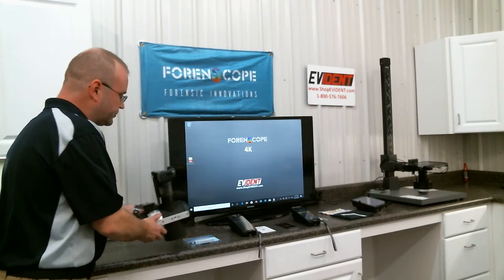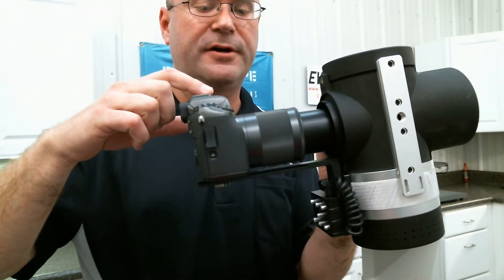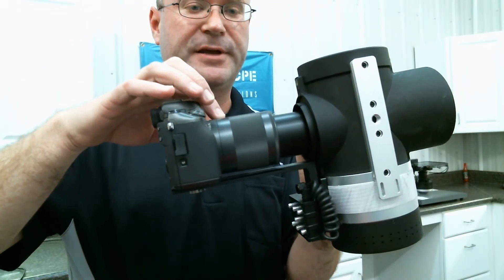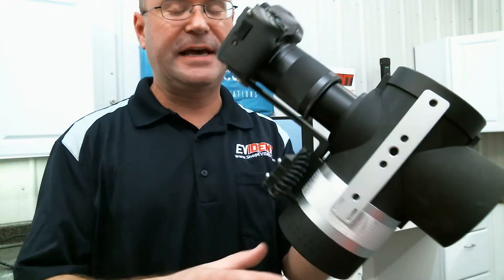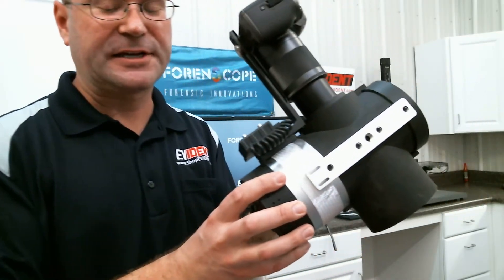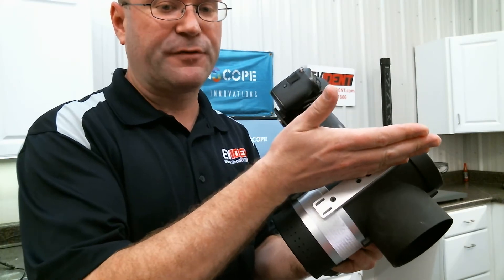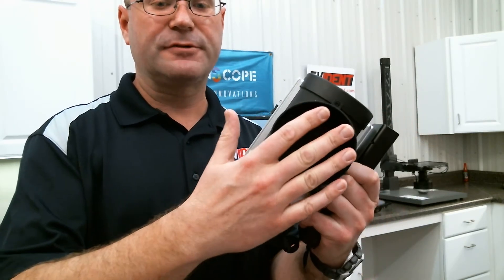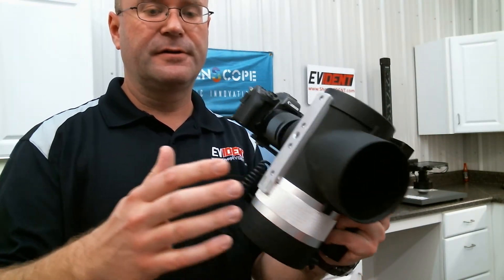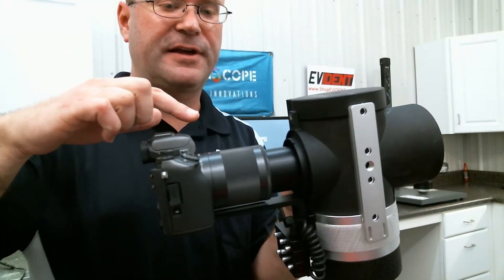Let's start off today talking about the contactless fingerprint system. This is the Forenscope contactless system. It consists of a Canon camera with a 150 millimeter telephoto lens attached to this axial light source. The light source is attached here. The light fires forward, strikes a mirror at 45 degrees, and travels out of the aperture here. The camera then sees along the same axis as that beam of light.